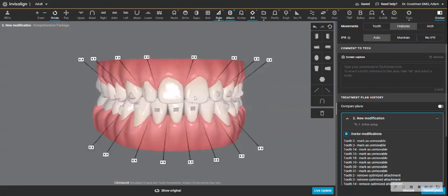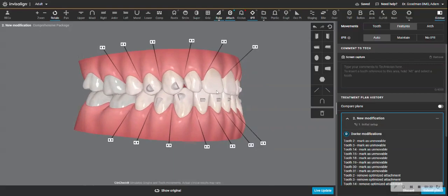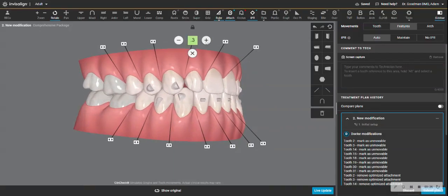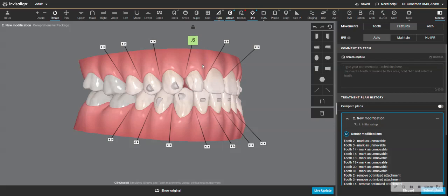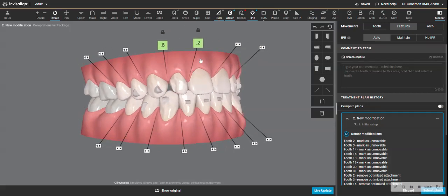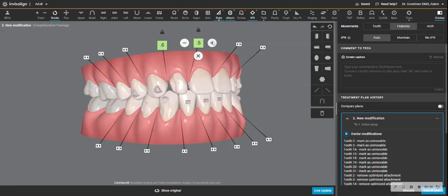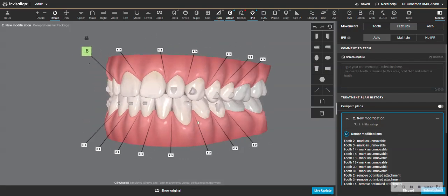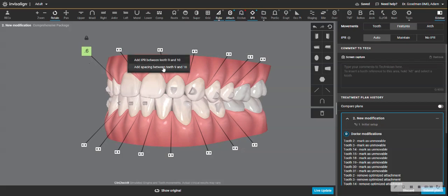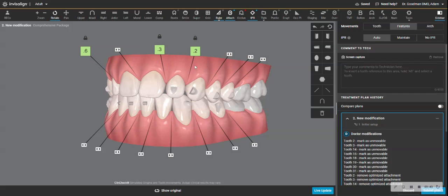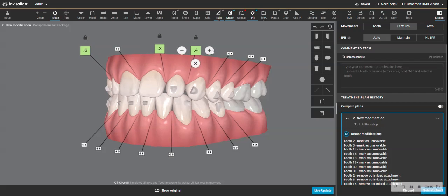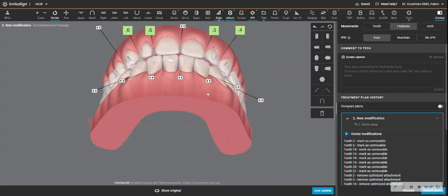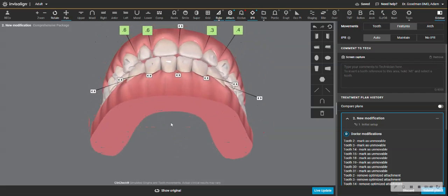So I am going to make some room around the culprit of the Bolton discrepancy. Because, you know, orthodontics doesn't solve every problem. The etiology here is the small laterals in part. I won't make as much here because that seems to be not as narrow, number 10, as number 7.